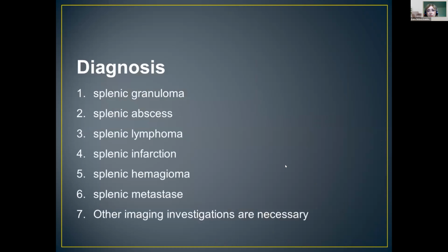So what is this lesion? Splenic granuloma, abscess, lymphoma, infarction, hemangioma, metastasis, or other imaging investigations are necessary.